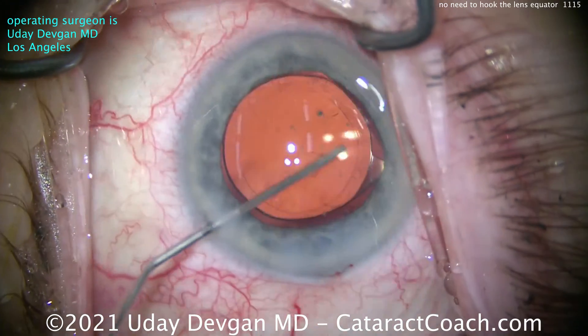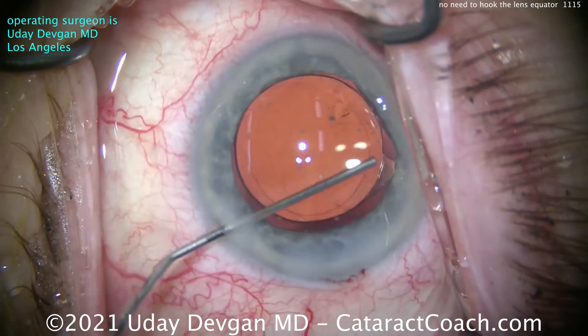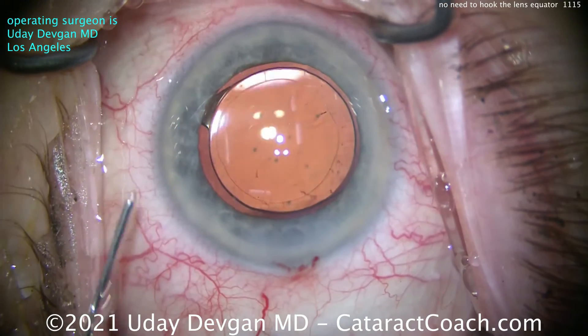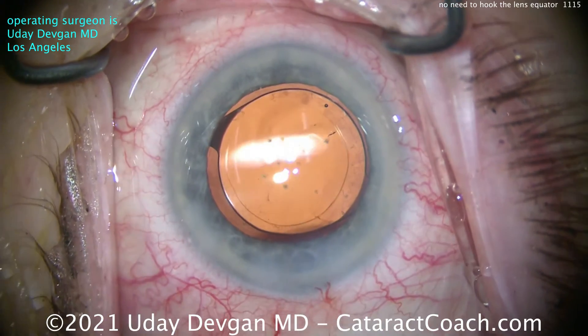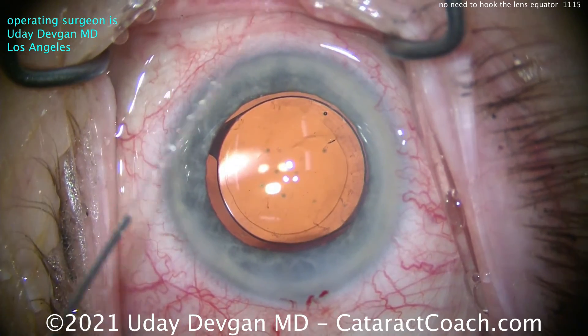Very little fluid was placed through the eye. Remember, it's not just about the ultrasonic energy — if you run 500cc's of fluid through the eye, you're going to really surprise and hurt that corneal endothelium. So you want to minimize the surgical fluid, the BSS, the amount you run through the eye. And that looks great.